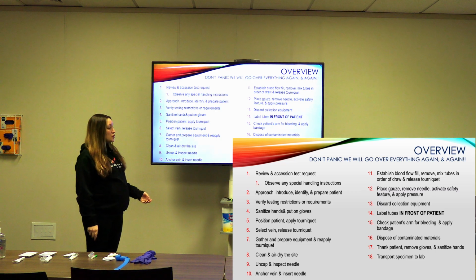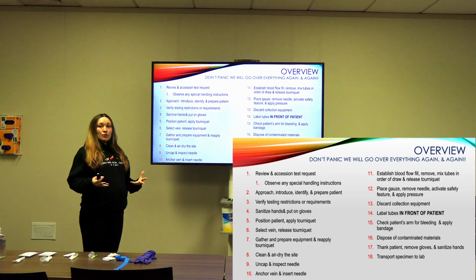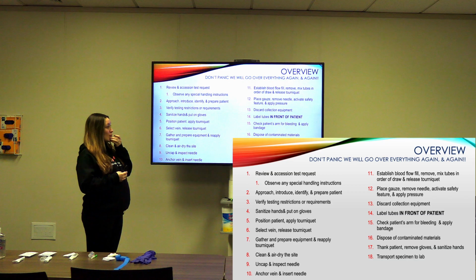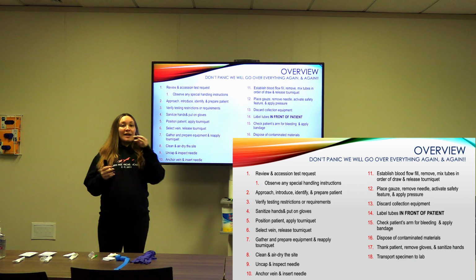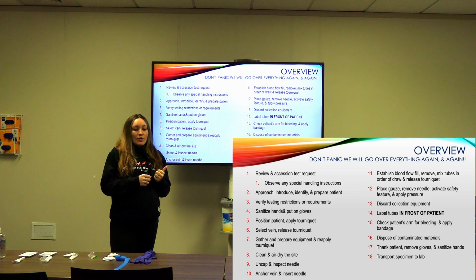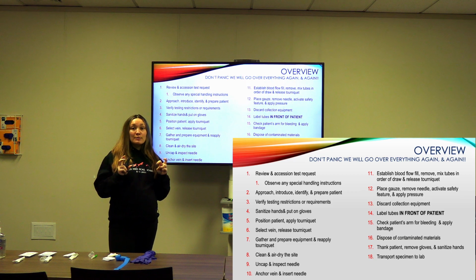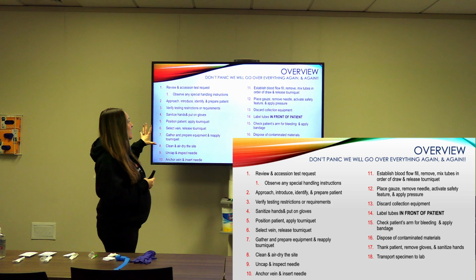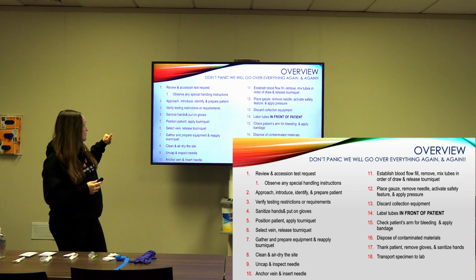So what you want to do is enter the room, introduce yourself, okay? And some of these are a little bit out of order, so we'll talk about the practicality of the order, and how it generally works when you're in the hospital setting and actually performing the procedure, because it is a little bit different than how it's listed here, okay?